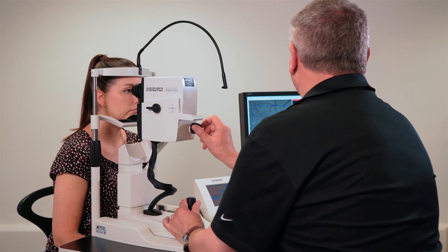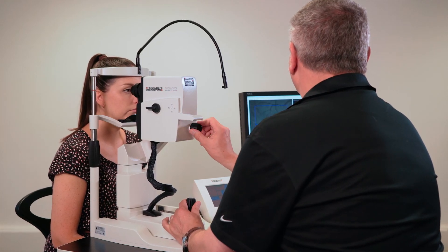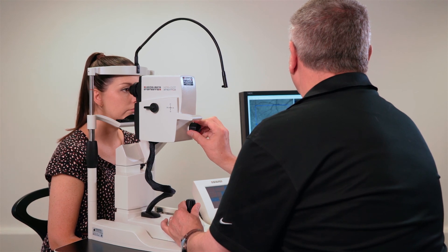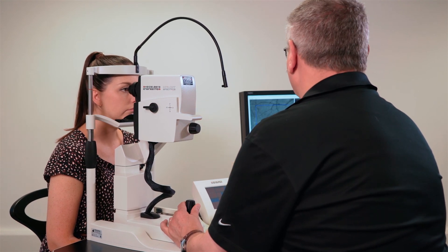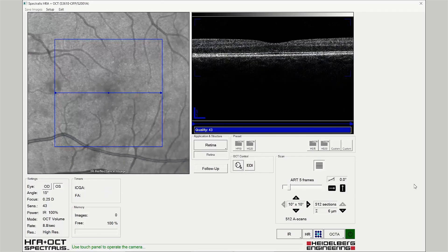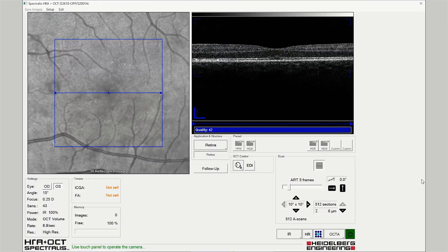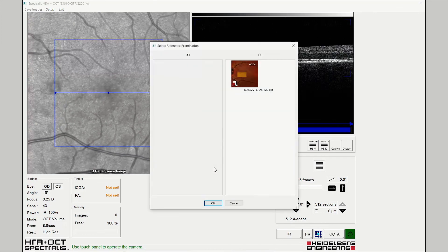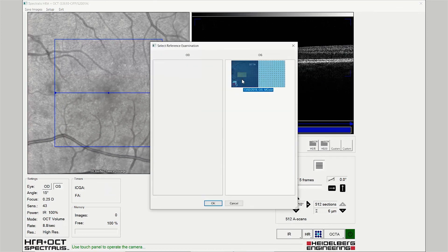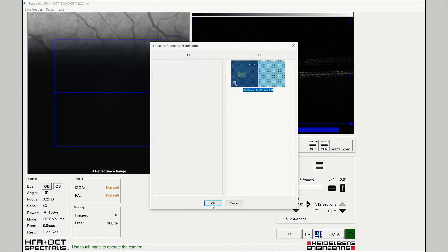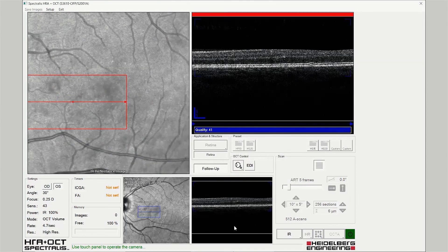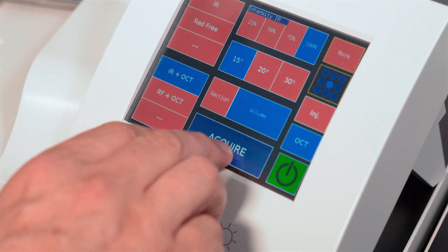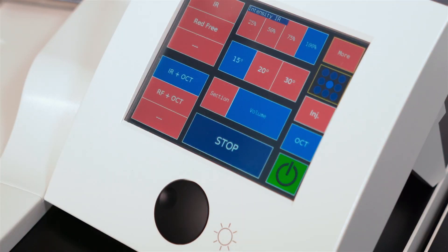To acquire the OCTA scan defined by the scan planning tool, launch the acquisition module, select the follow-up menu, and load the reference scan. Acquire the image in the normal way.